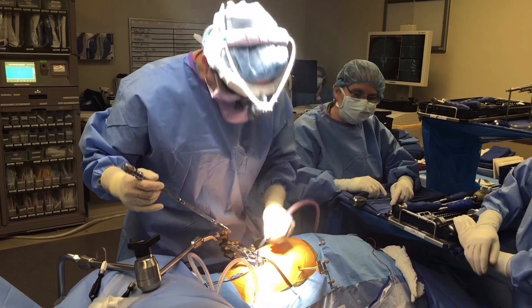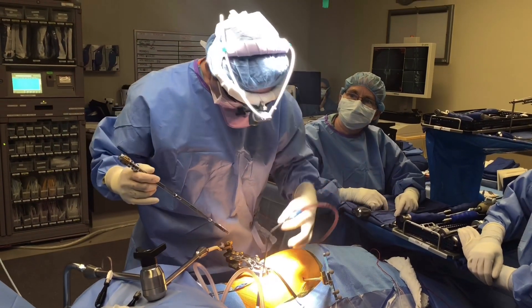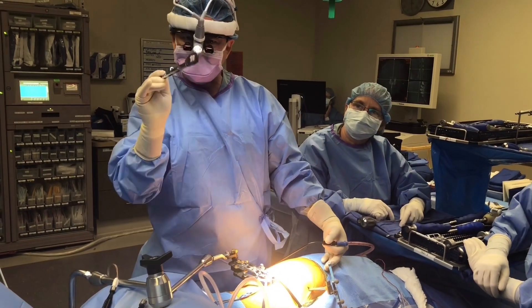Alright, I have the discectomy done. It went really well. You have very good bone. The disc was completely degenerated. It came out very easily. Now I'm going to put in the implant.